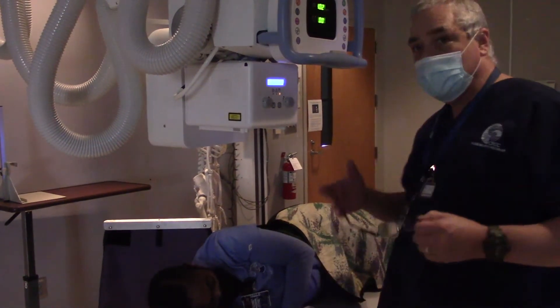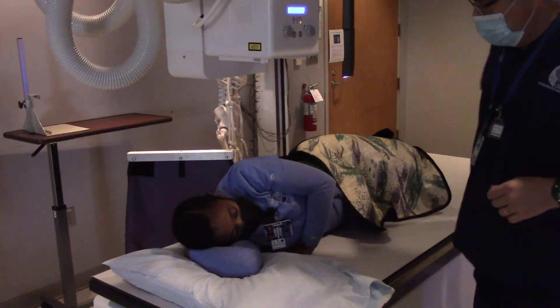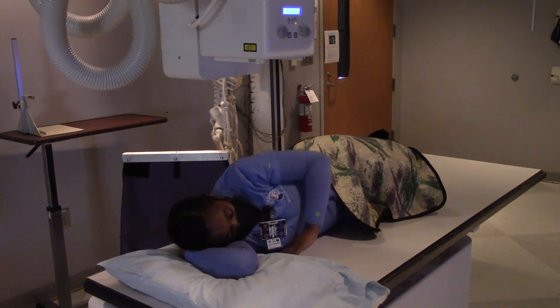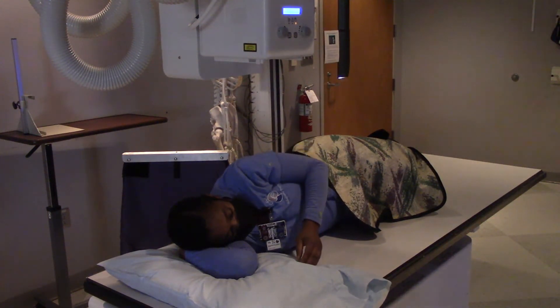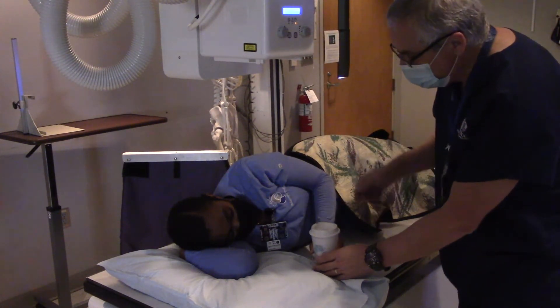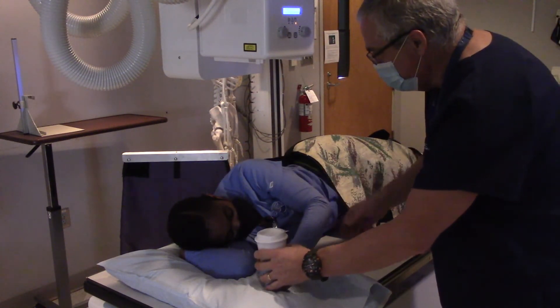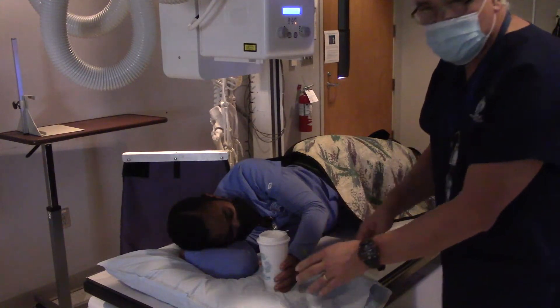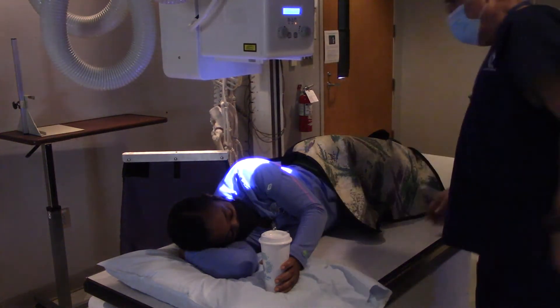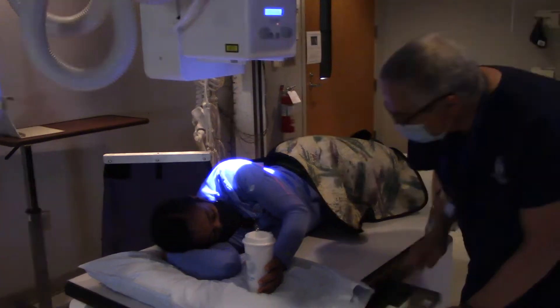However you want to do it is fine. All right, I'm going to get my patient holding her cup of barium once again, and I'm going to have a straw rigged up so that she can drink it easier. All right ma'am, I need you to bring your arm up out of the way as much as you can. I'm going to need a really long straw — a silly straw, that would be perfect. All right, that looks good. This time I'm going to mark side down, so I'm going to put a right marker on here.